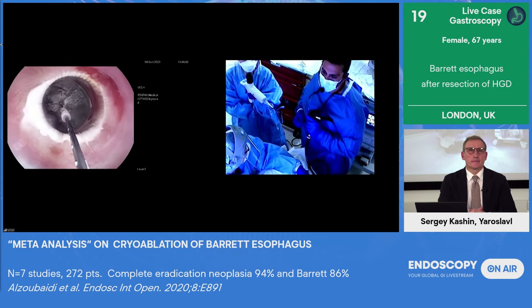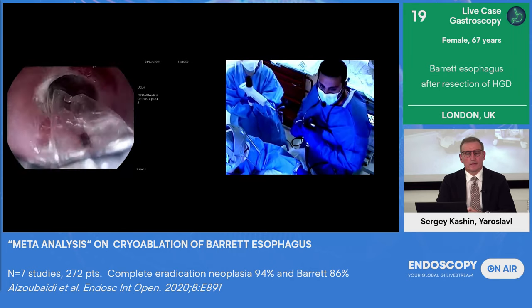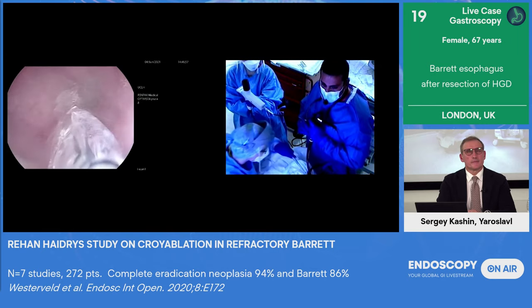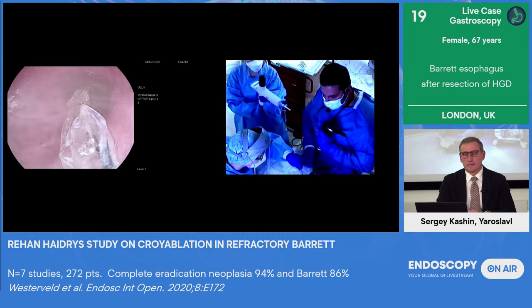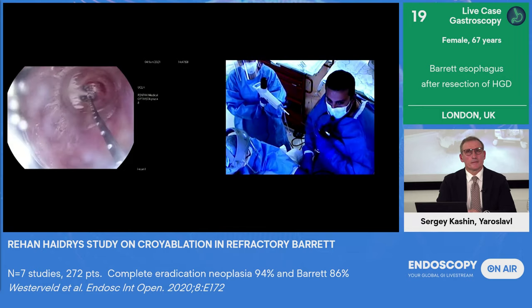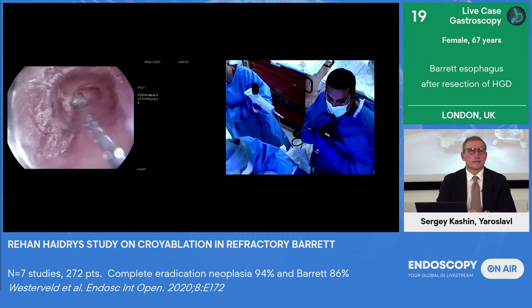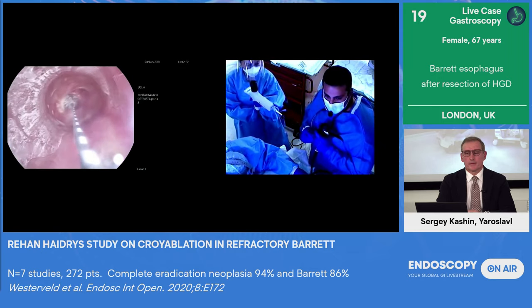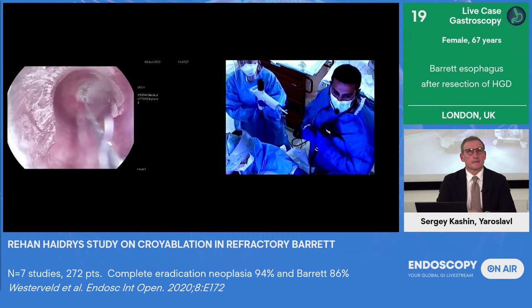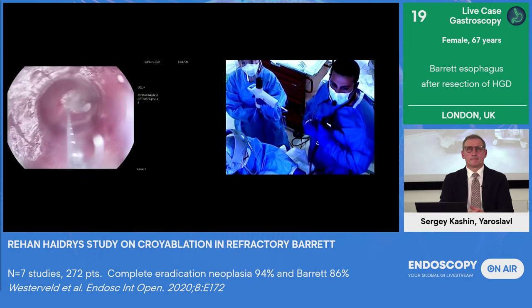Yeah, great question. So the issue that we're all faced with in endoluminal therapy in the esophagus is the risk of stenosis and stricturing. And we know with combined ER and RF, the stricture rate is in the region of about 10%. So there are hypothetical advantages of this device because of the cryo, essentially because of the rapid freeze-thaw sequence; the hypothesis is that the submucosa is preserved. Now, the preliminary readouts on this show that the stricture rate is not dissimilar to what we're seeing in RFA, but the data will inform me. But at the moment, it appears the stricture rate is probably the same.